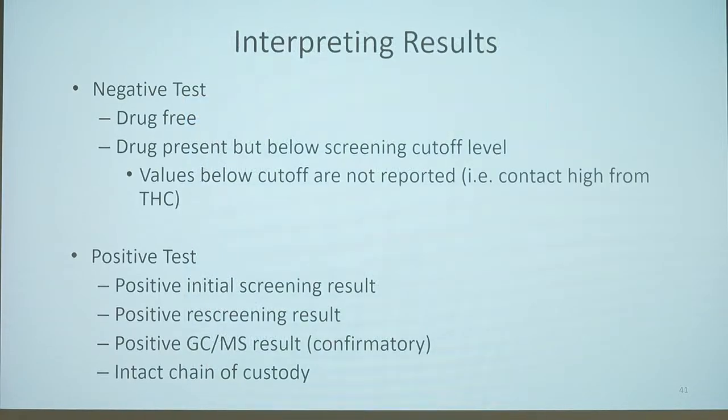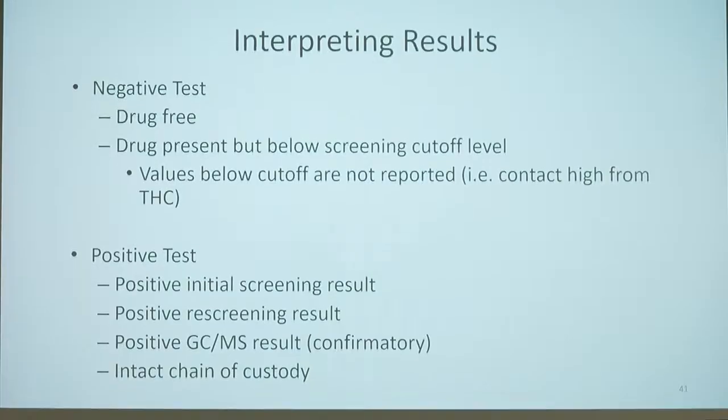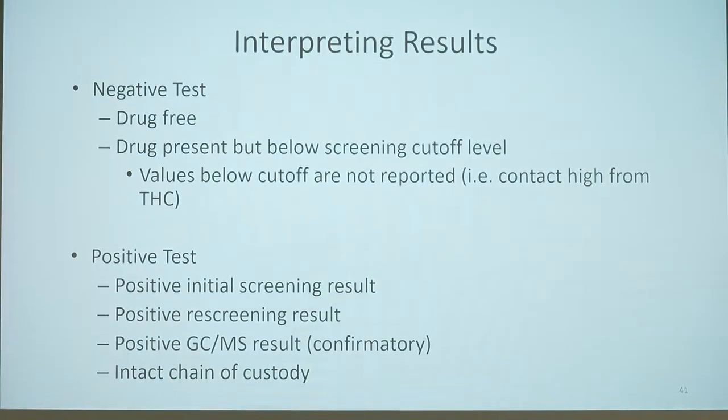So when we are looking at our DOD testing, it's a two-phase approach. We have the urine drug screening test first, and then we have the confirmatory test. If a person tests negative for the UDS, the initial screening, that doesn't mean that there's no drug in the sample. It just means it's below the cutoff level. So that patient is good to go.